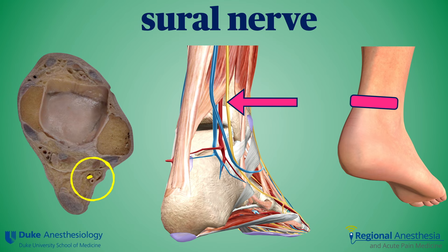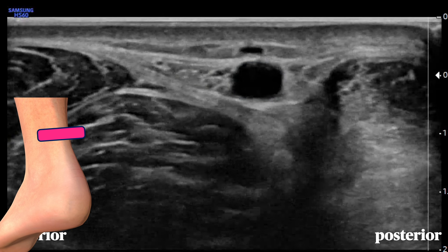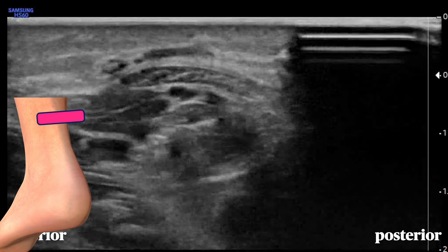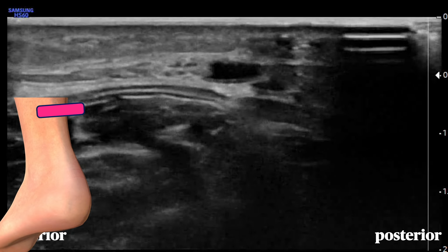The sural nerve can be found just behind the lateral malleolus, beside the Achilles tendon. It innervates the lateral foot. With a light touch on the probe, you should see the short saphenous vein and the raspberry-like sural nerve beside it. Sliding the probe up the posterior calf brings both nerve and vein up onto the Achilles tendon, which helps with identification, but it can be blocked at any location.